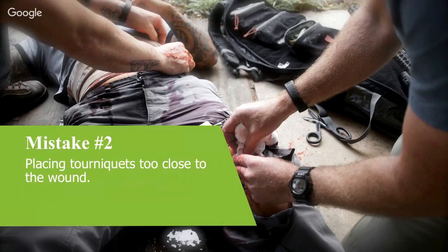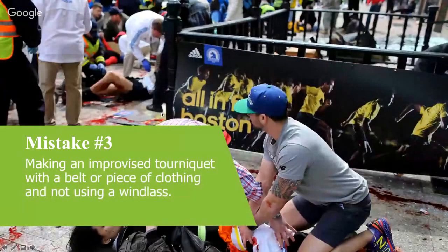All right, excellent. So there are some great questions coming through, and interesting poll results there as well. I think everyone should be able to see them now. So I'm going to talk about mistake number 3: making an improvised tourniquet with a belt or a piece of clothing and not using a windlass.